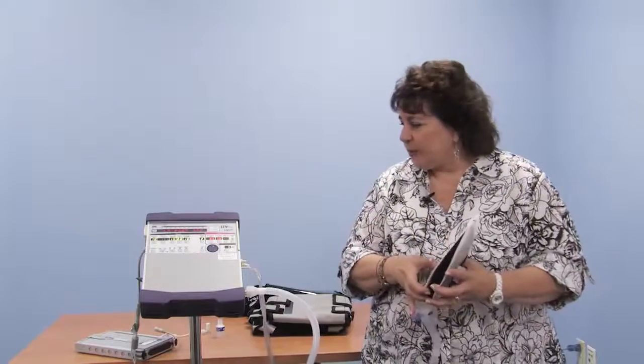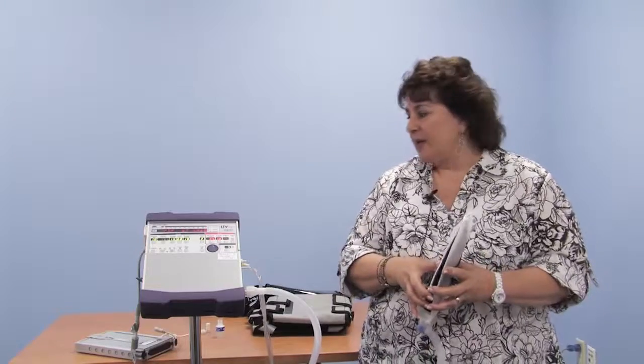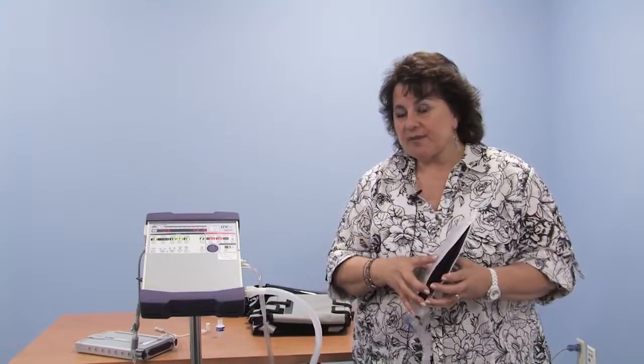When they're awake, typically, they're breathing and they generate the breaths, and it doesn't necessarily do that. But we hear more comments from folks that 10 is flashing or the pressure support number is flashing when they're sleeping and when the cuff is deflated or if it's absent. So we can just talk about it so you'll understand why it's happening and what the precaution is.